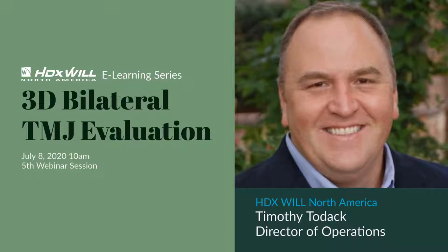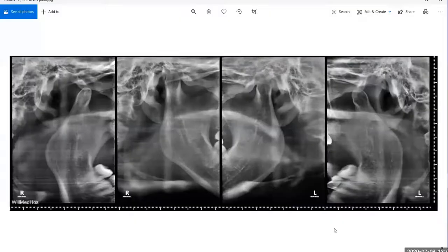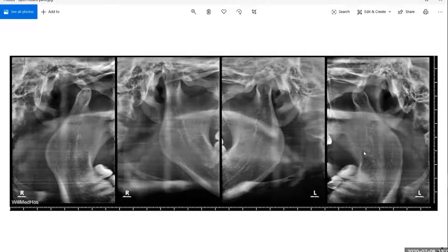Let me go ahead and open some of these up. This would be what our open mouth/closed mouth series looks like. In the HDXWill CBCT there is a setting to be able to do open mouth/closed mouth TMJ.